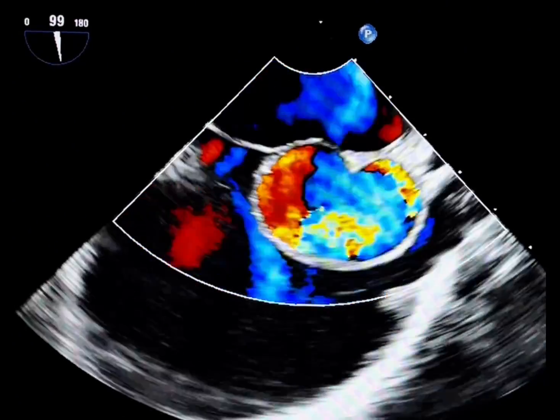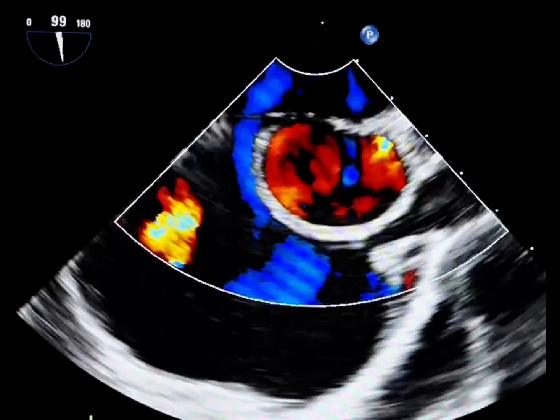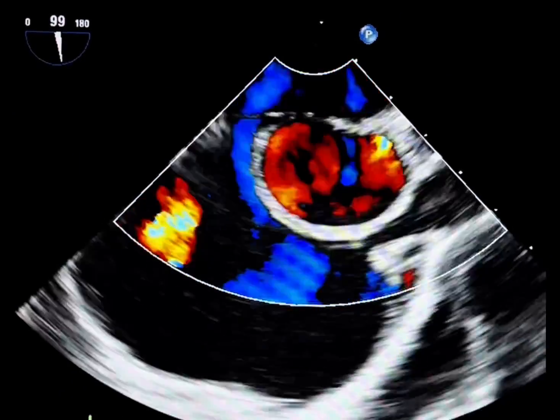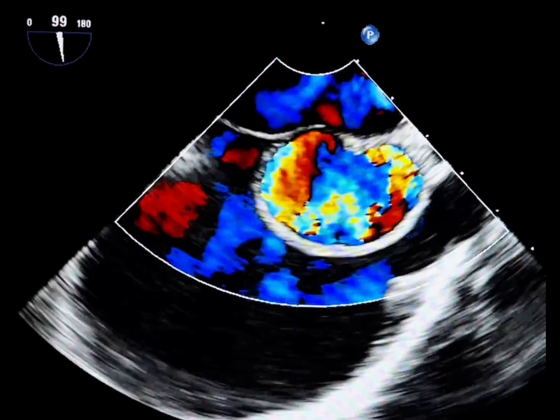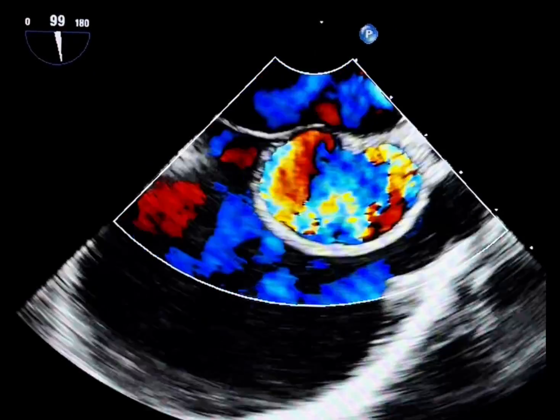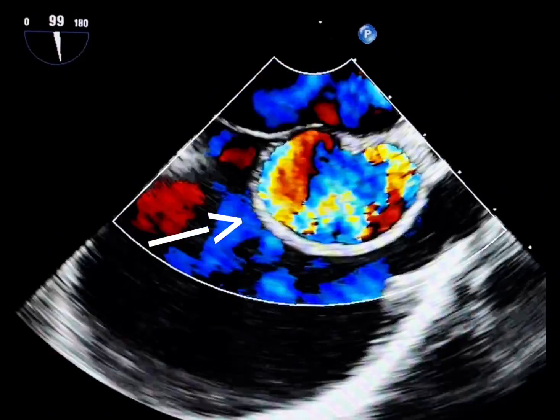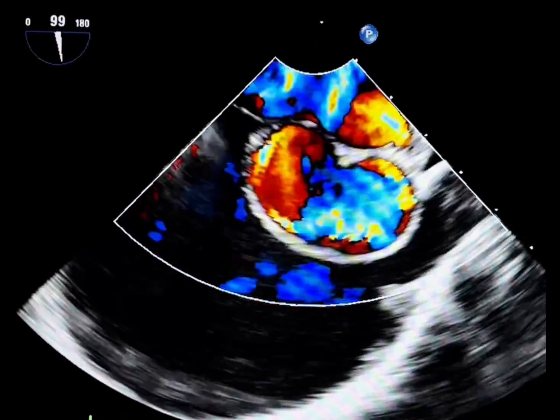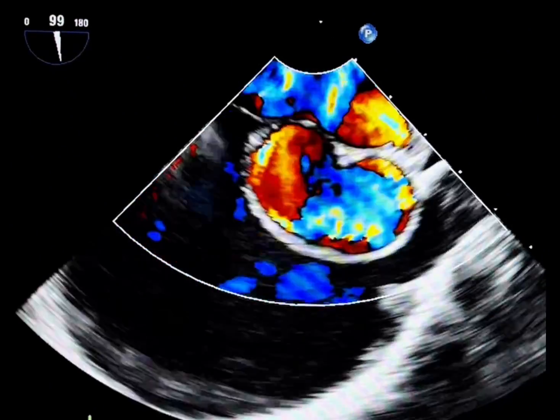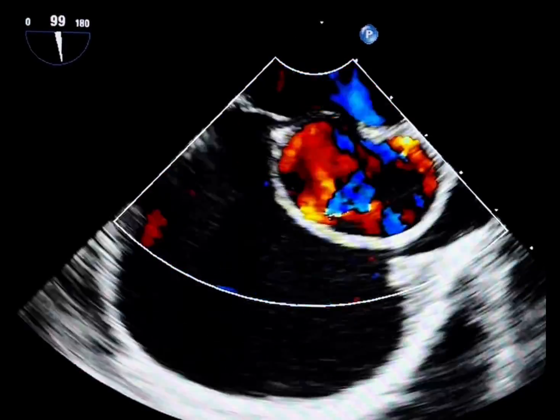Although the patient was referred to investigate a possible atrial septal defect, no ASD, PFO, or PAPVC was found. Instead, a large structure with turbulent flow was observed. The key point here is the continuous flow pattern that spans both systole and diastole.